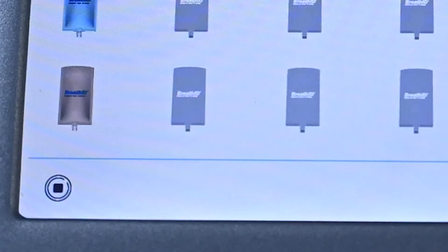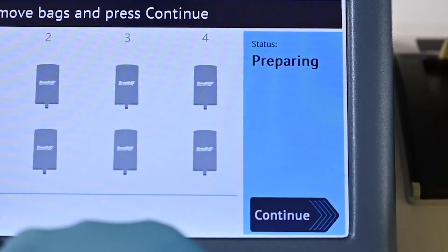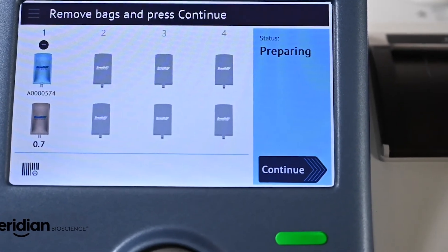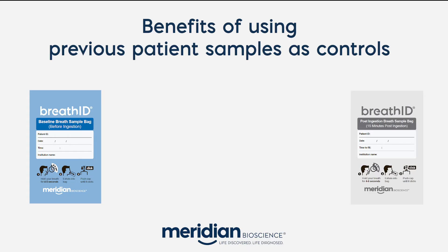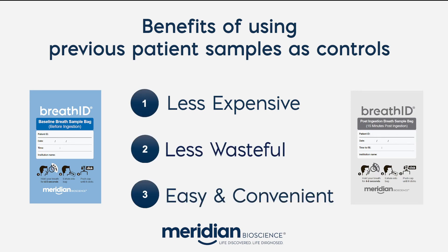A unique feature of BreathID Smart is the option for automatic QC generation. Once the batch is completed, a barcode icon displays in the lower left corner of the screen. This button allows the user to create controls from the previous patient samples. Once pressed, BreathID will automatically print labels to be placed on the patient samples that were eligible to be used as controls. Controls can be run for up to 14 days after they are chosen. Using previous patient samples as controls is beneficial because it's less expensive, less wasteful, easy, and convenient for workflow management.